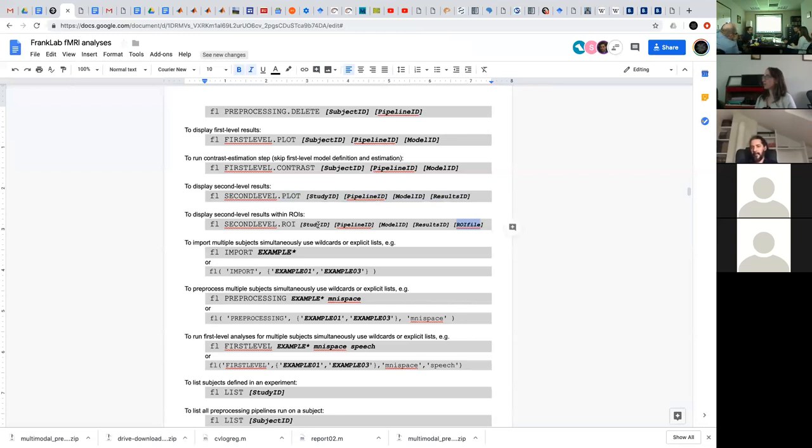So if I was creating various ROI masks, what space would I use? Right, as long as it's MNI space, the difference between the different MNI variations is really minor. Just keep it as long as it's defined in MNI space, and if in doubt, use the MNI 152 space, which is kind of the closest one.